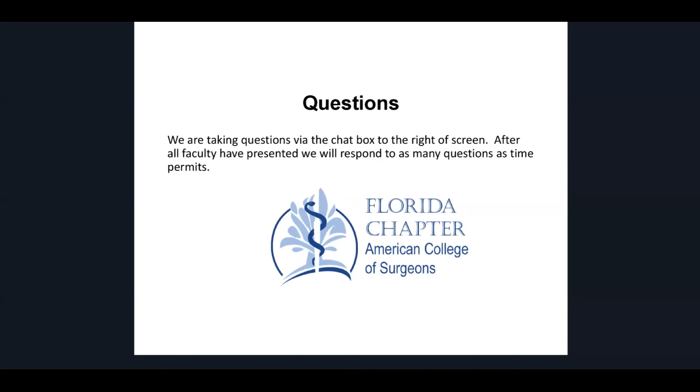The HIFU systems, there are two HIFU systems. There's a Sonablate system, which is a US-based system, and there's an EDAP system that's based out of France that has basically two systems. One's a focal one, and the other one is basically their original EDAP system. All of those systems have allowed for an integration of the fusion technology, so that whenever we identify a lesion on MRI and have done a targeted biopsy, we can import our targeted biopsy images into the HIFU system, and then we can target and treat our biopsy lesion.